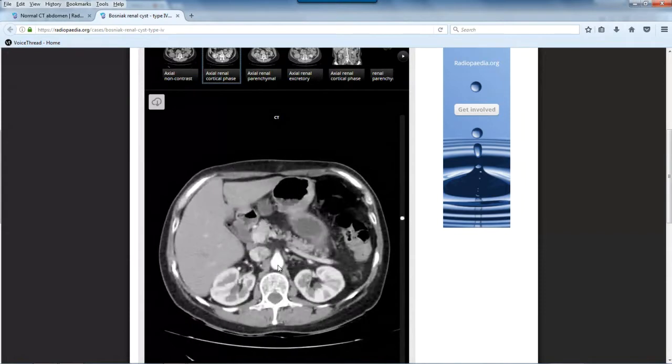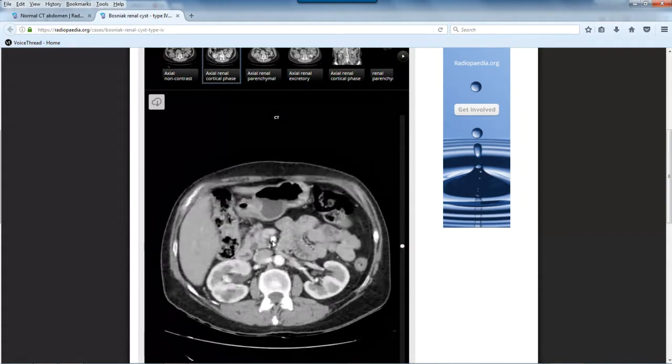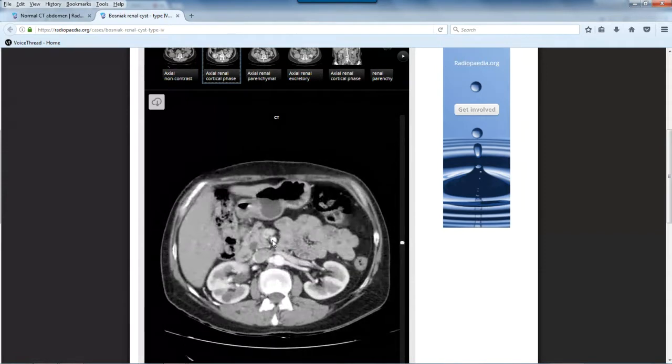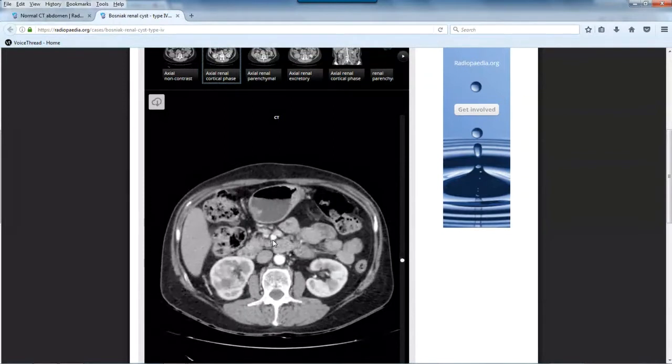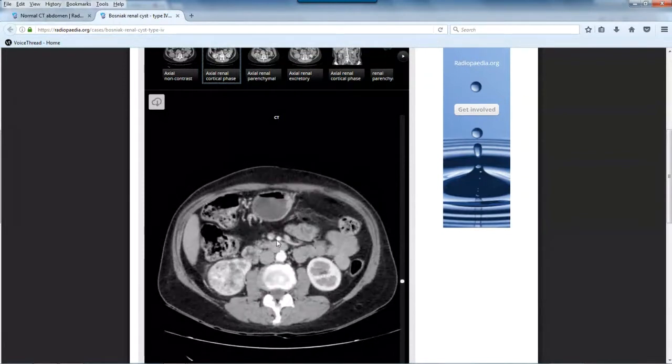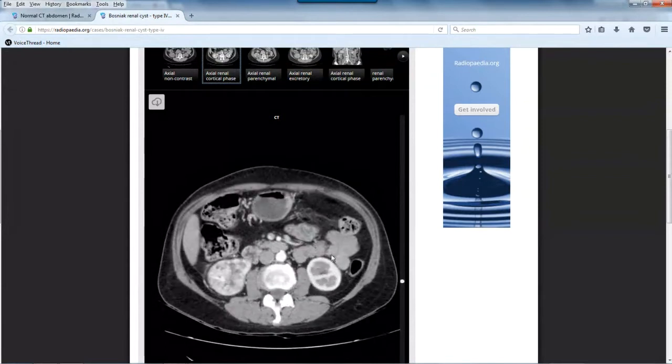Going down to the SMA, it comes off anterior, and now it shoots straight down. That's why we're seeing it like this circle. It's going to go straight down, okay? And then it's going to head down, branch off and feed the head of the pancreas over here, and then start supplying the large bowel. Branches are going to head off. There's a branch heading over to the large bowel over here, on the left side of the patient.